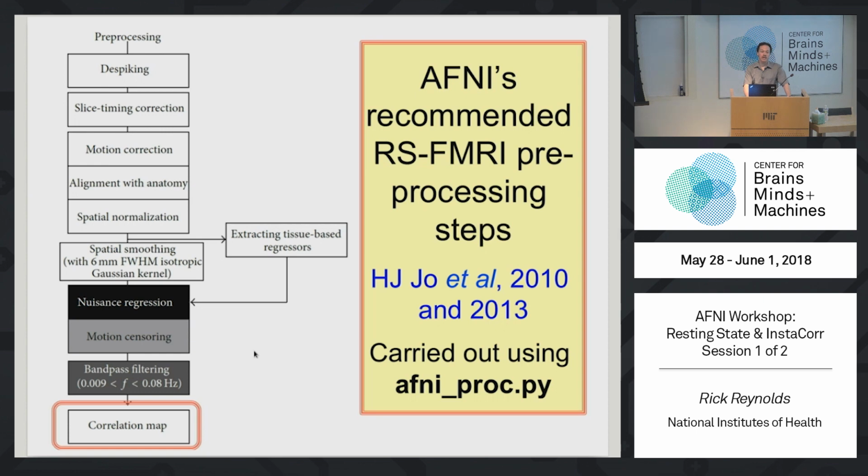The people that write the ICA software usually expect their software to handle all of the things that you should be removing. So they often don't want everything projected out. They think we'll handle the motion, and particularly like detrending. Actually, detrending can possibly throw it off if they don't expect demeaning. But that depends on the ICA software. So you kind of have to discuss what steps are acceptable with the people writing the software, because that'll vary.